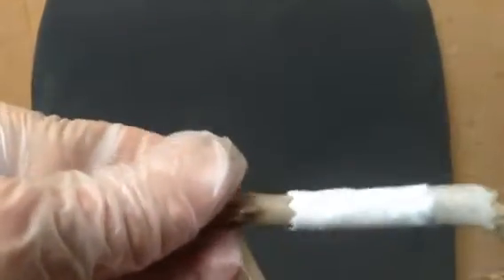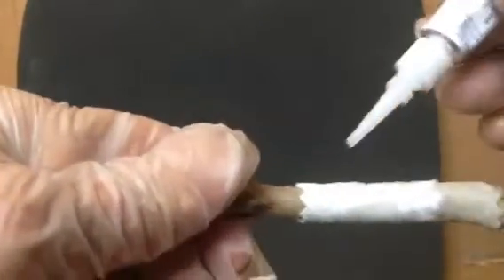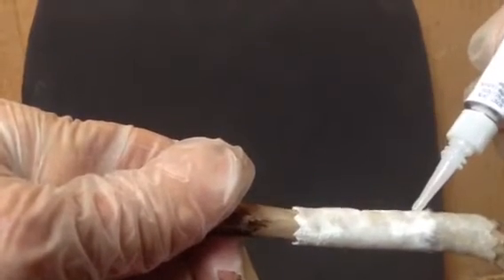The part that I missed shows up as a lighter color all along in here. So it's obvious where the super glue is needed by the lighter color indication, and we just saturate that now.